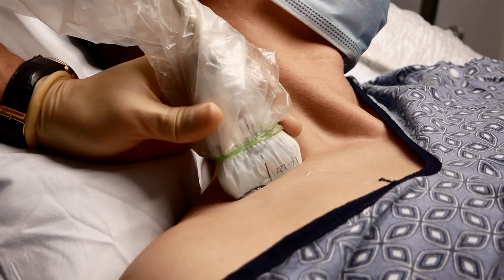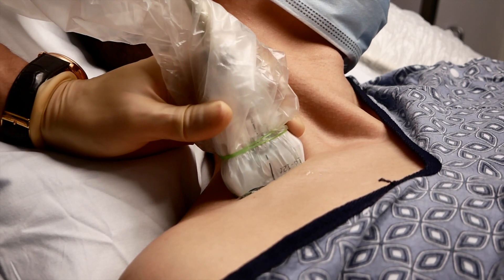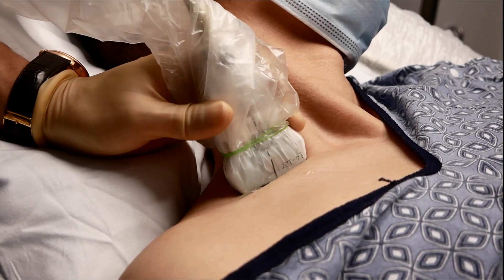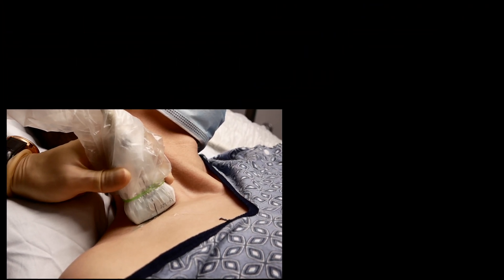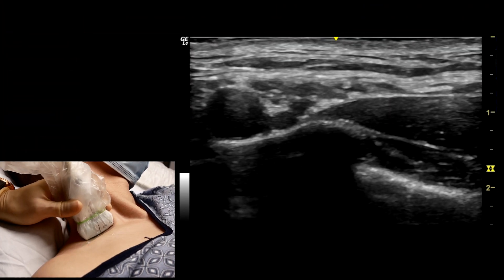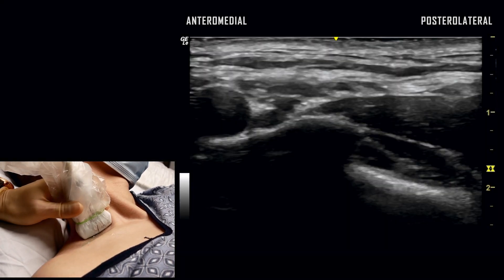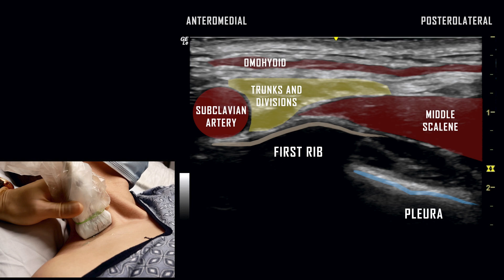The patient is positioned supine with the head turned away from the transducer. The transducer is placed at the supraclavicular notch. The first view obtained is that of the supraclavicular approach, where trunks and divisions of the brachial plexus are identified with key anatomic landmarks including the subclavian artery and first rib.